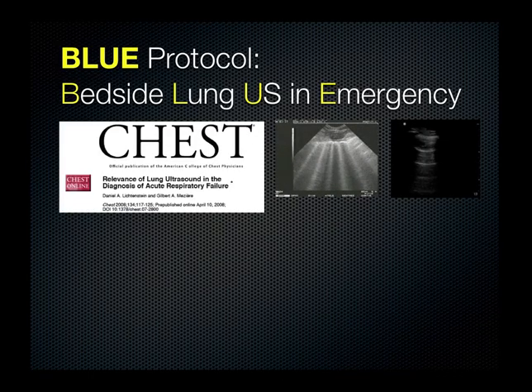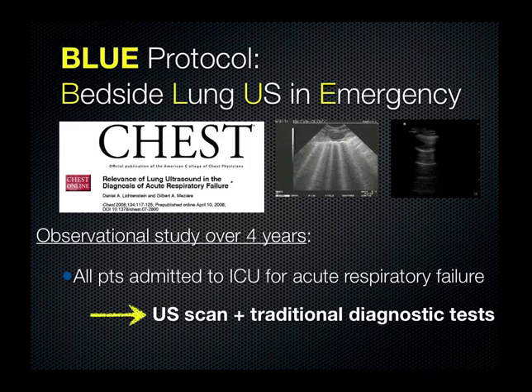Daniel Lichtenstein of France is one of the key fathers of pulmonary ultrasound in critical care. He developed the BLUE protocol to diagnose causes of acute respiratory failure. He did this by taking patients with a diagnosis of acute respiratory failure and scanning their chest, alongside the usual diagnostic tests, including chest x-rays and CTs. What he found was that he recognized certain patterns of artifact, of A lines and B lines and sliding and so forth, that correlated with the ultimate clinical and radiological diagnoses. This was an observational study over 4 years, and it took all of the patients submitted to his ICU with one sonographer scanning their chest.